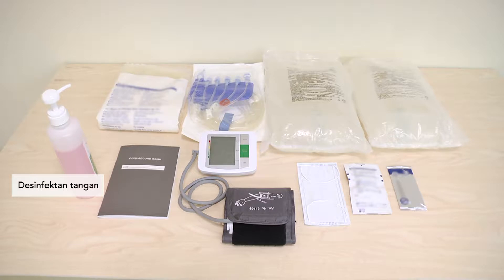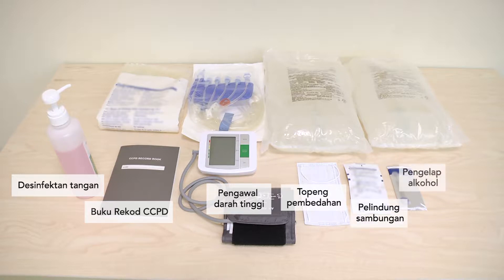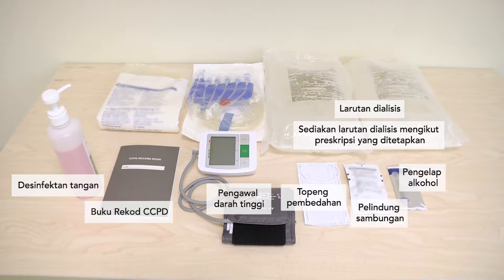Hand disinfectant, CCPD Record Book, Blood Pressure Monitor, Surgical Mask, Connection Shield, Alcohol Wipe, Dialysis Solution — prepare the prescribed number of dialysis solutions — APD Cassette, and Drain Bag.